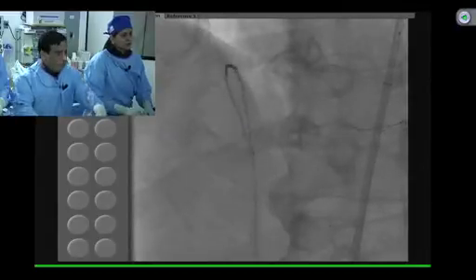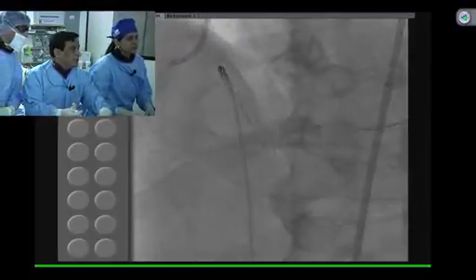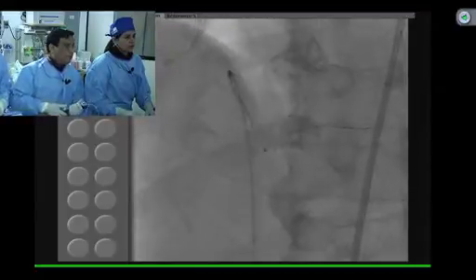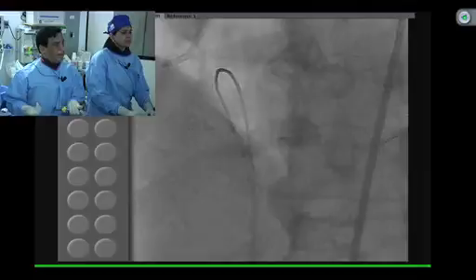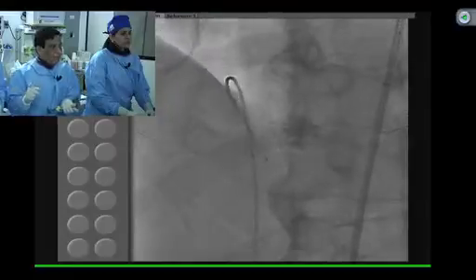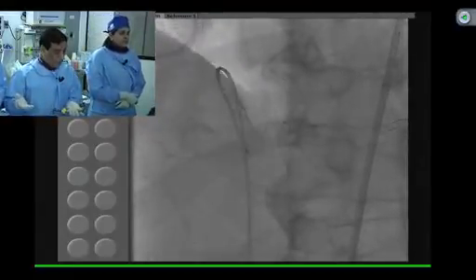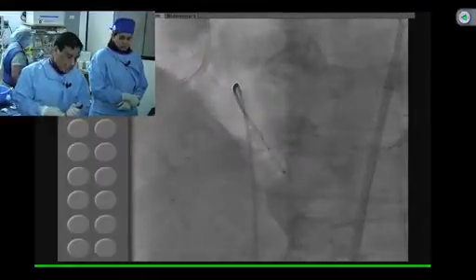Yeah. Well, that's a very good point. No, your wire is in, look at this, wire of the AV. Okay, a little distal. Okay. Yeah, a very good point. The question comes up, and that is our practice pattern. The reason is that complex will require additional amount of time, additional amount of dye. If you are questioning, then the question is very simple: that you have a total occlusion, and you think that if you cannot open the total occlusion the patient will go for surgery, then yes.